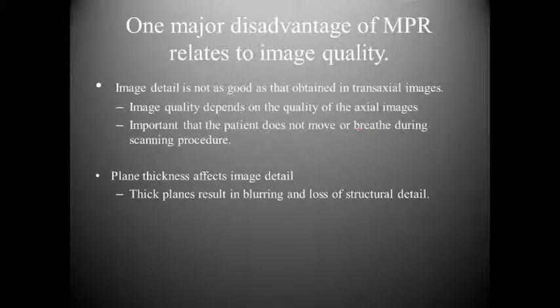Image detail is not as good as that obtained in the transaxial images. Image quality depends on the quality of the axial images. It's important that the patient does not move or breathe during the scanning procedure. Any movement will disrupt this.